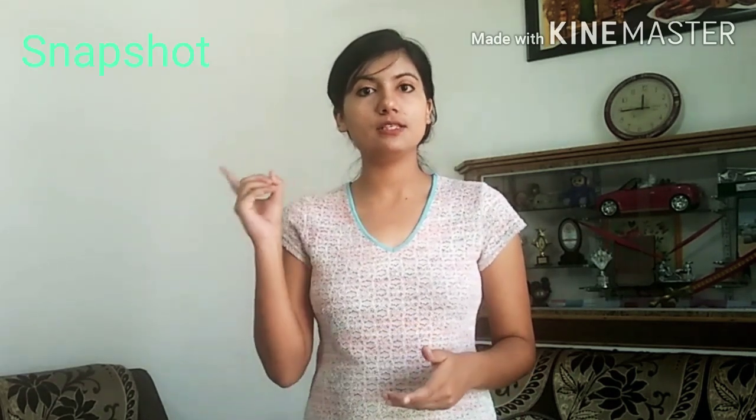PQRST: different waves and types of changes in them related to different pathological conditions of your heart. Before moving to the P-wave abnormalities resulting due to different pathological conditions of the heart, mainly related to the atria, we must have a little snapshot of what we learned in the previous video.